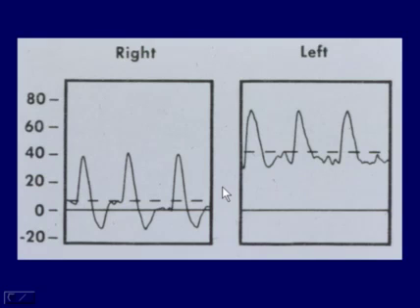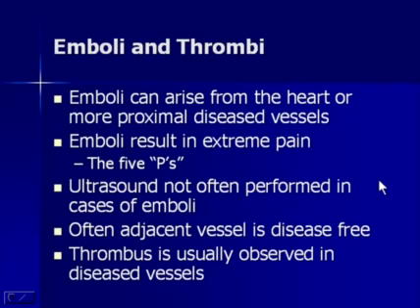we'll know if we're dealing with a fistula. Here is a Doppler waveform, but the spectral Doppler waveform on ultrasound would look similar. In the right limb here, this is a normal high resistance multiphasic pattern. In the left limb here, this is indicative of low resistance, lots of diastolic flow, and in this case, that diastolic flow is going out through a fistula into the deep venous system of the leg.